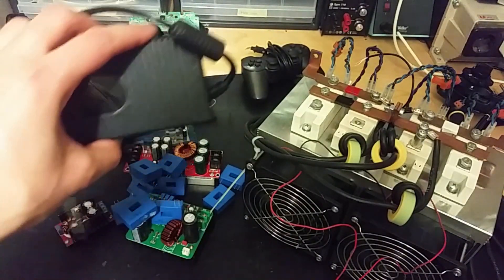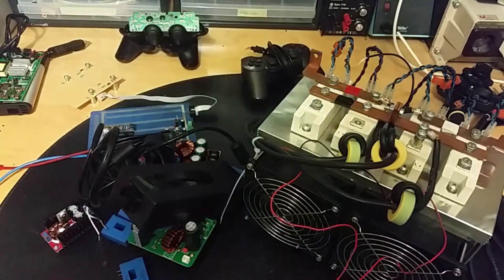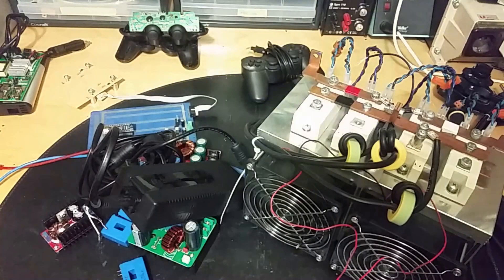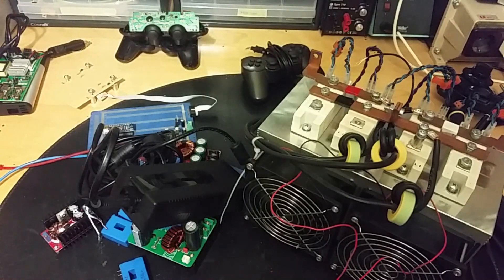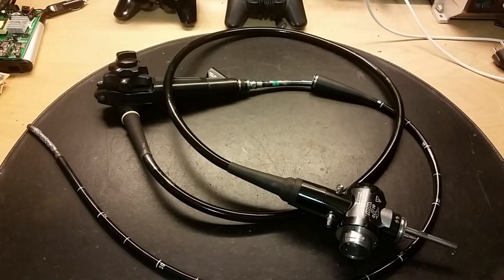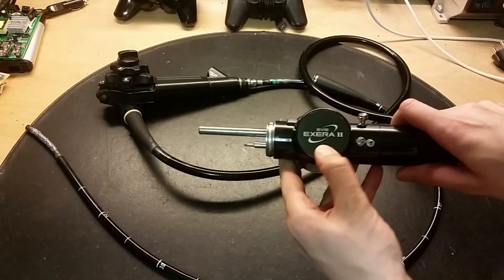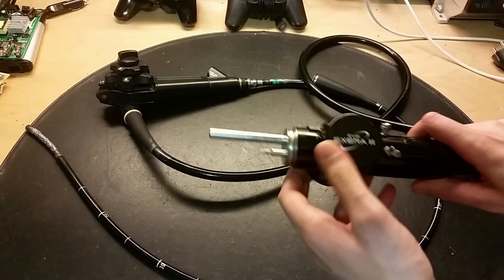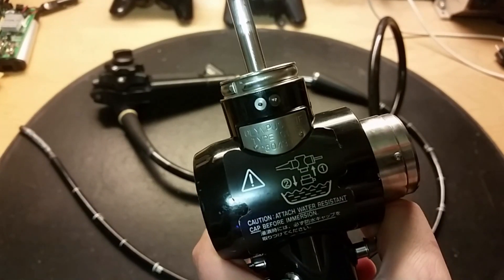You can actually connect those power supplies in series to get more voltage. Anyway, this is not the subject of the video - the subject of this video is to have a look at the endoscope. Here we've got the endoscope, I've removed the other things. It's an EVIS Exera II, made by Olympus, and we've got some type numbers here.